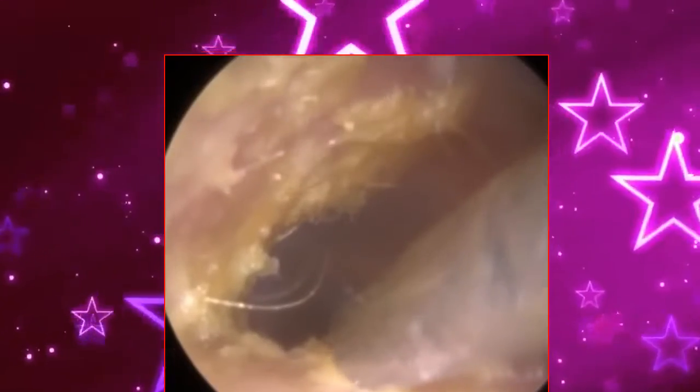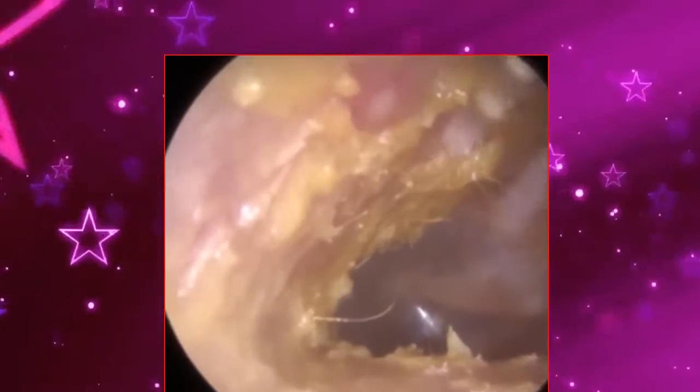We just don't want to make contact with the ear canal. They've got some otitis externa. I don't want to graze the ear canal, which is only going to exacerbate their condition. The patient has been prescribed some antibiotic spray from their doctor, but quite rightly the doctor advised that if you are able to clean your ears first, it'll be more effective, because that debris will absorb a lot of the antibiotic and it won't make contact with the canal wall. So I just want to remove as much. You can just see how I'm delicately hovering over.